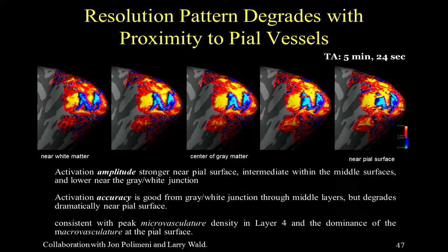But actually, out here, you can see that the fMRI signal is not itself a veridical representation of what the neurons are doing. That is, the M has been corrupted. Probably there's a pial vessel running here and maybe another one down here, and so much of the M has been lost if I sample out at the pial surface. You're probably better off going back a couple of millimeters, actually about 3/4 of a millimeter, and sampling somewhere in the middle of the cortex, where I still have power to see effects, but it's more accurately representing what the underlying neurons are doing.